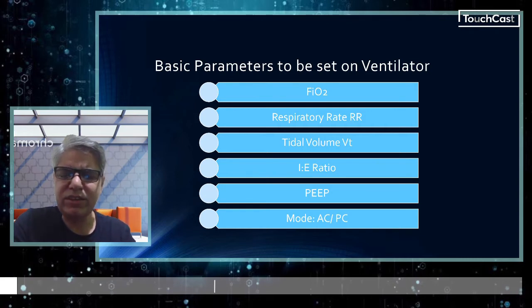So around 93, 94, one should be happy with those sats levels.